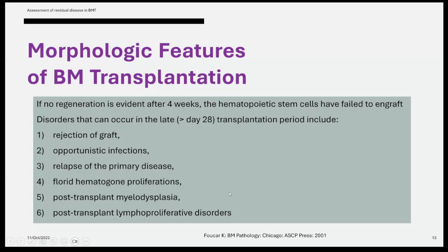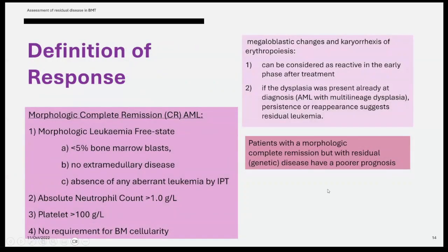So be careful. And that's why in post-chemo or post-transplant marrow, the role of having preferably a complete range of IHC is very crucial. Okay, I will talk about this one.